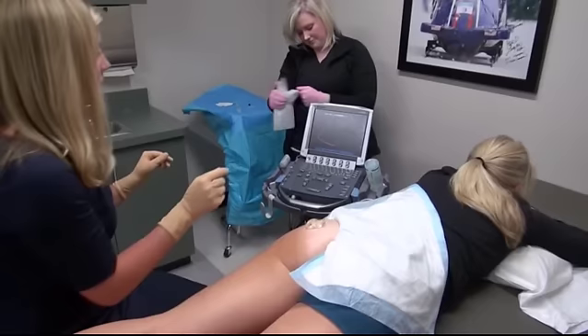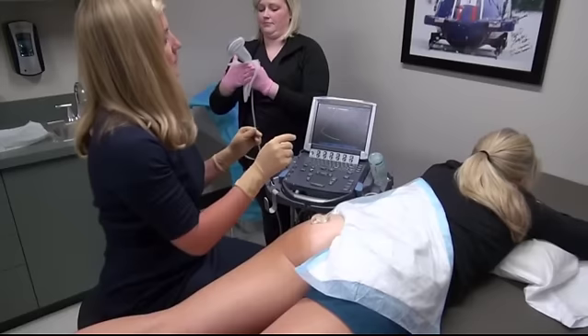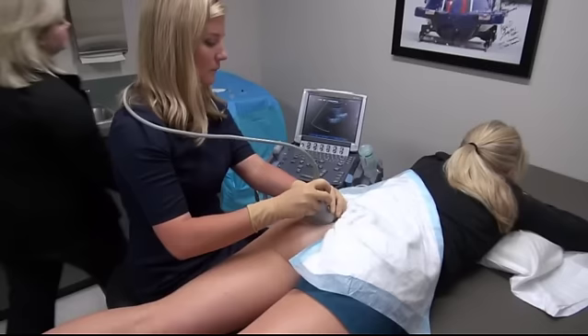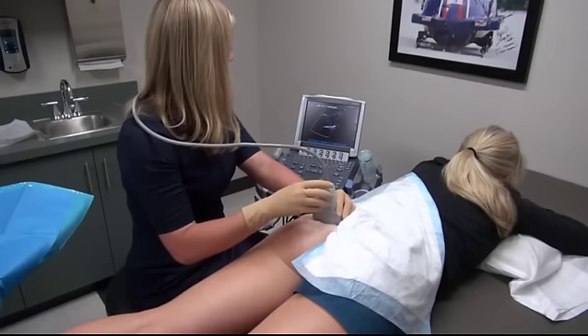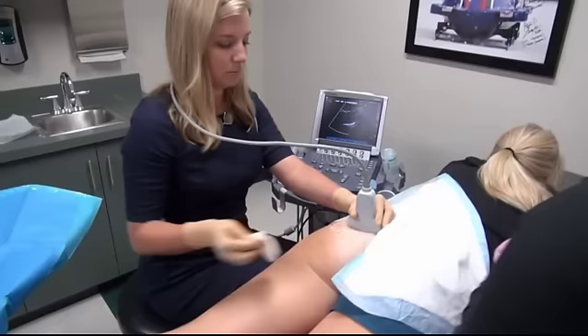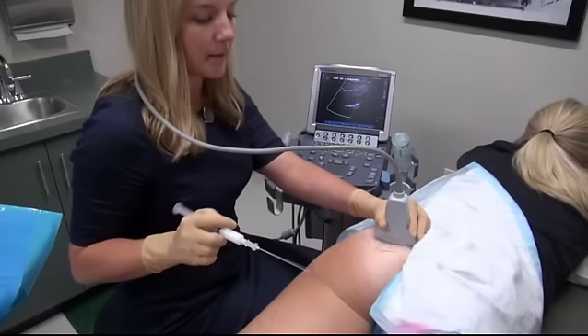The provider grasps the ultrasound transducer, pulling the transducer and cord through the germicidal cloth. The piriformis is then visualized in long axis and the sciatic nerve in short axis. The procedural assistant moves the sterile tray within reach of the provider. The excess gel is wiped away with a sterile 4x4 gauze. The skin is sprayed with ethyl chloride and the spinal needle is placed approximately one half to one centimeter in front of the probe and inserted bevel up until it enters the piriformis musculature, avoiding the sciatic nerve.